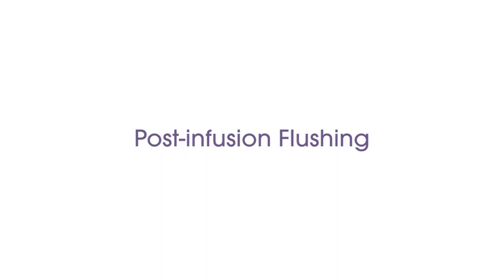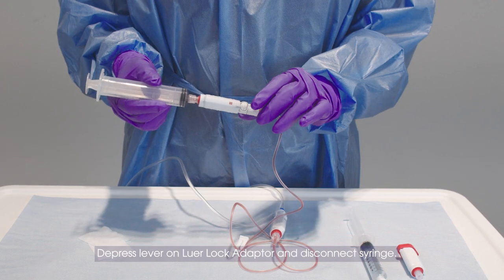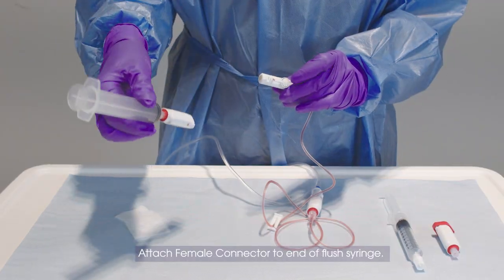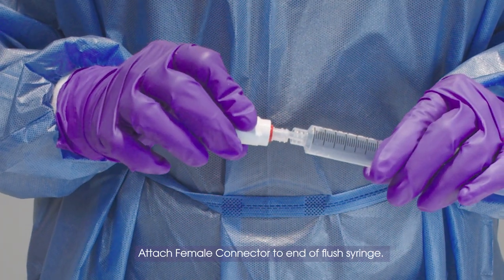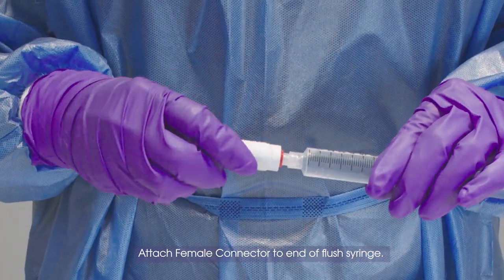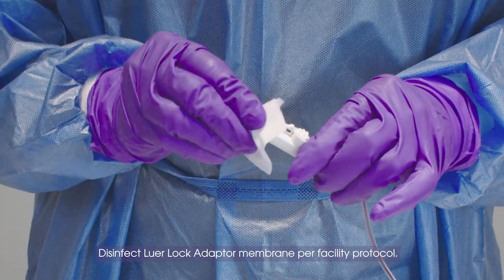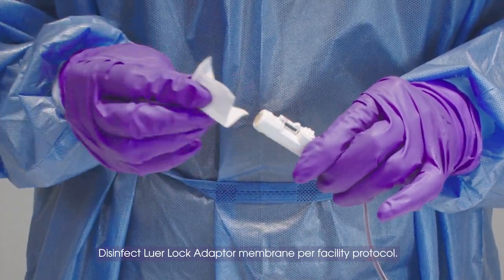For post-infusion flushing, depress lever on lure lock adapter and disconnect syringe unit. Attach female connector to end of flush syringe. Disinfect lure lock adapter membrane per facility protocol.